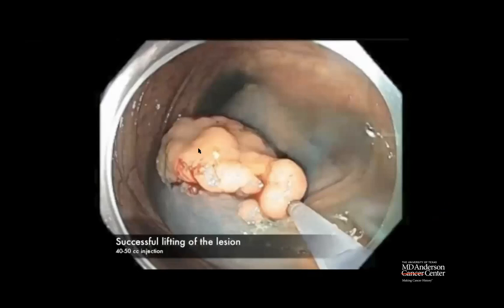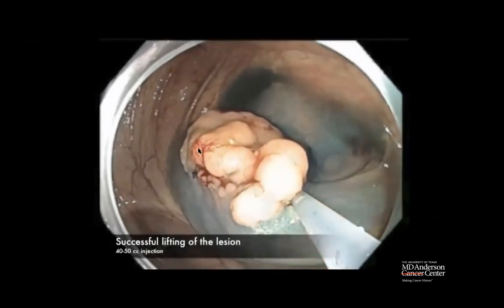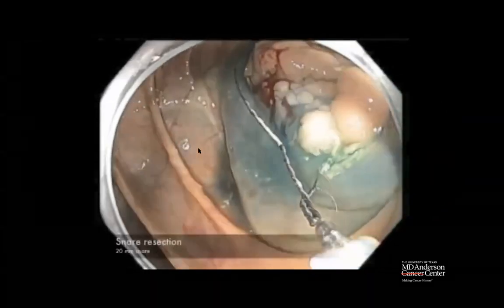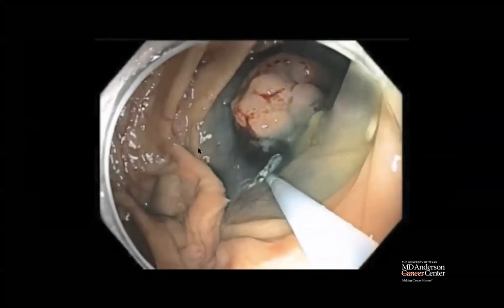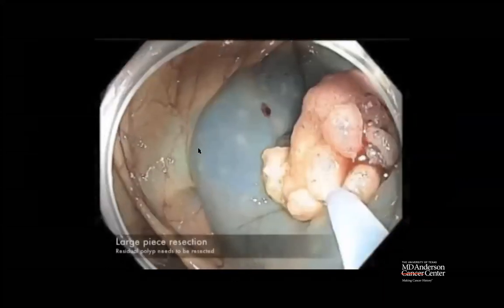So we injected quite a bit of fluid, and we took a large snare to cut the polyp. And as you can see, it's almost 40 ml of fluid that was injected, and we decided to cut.